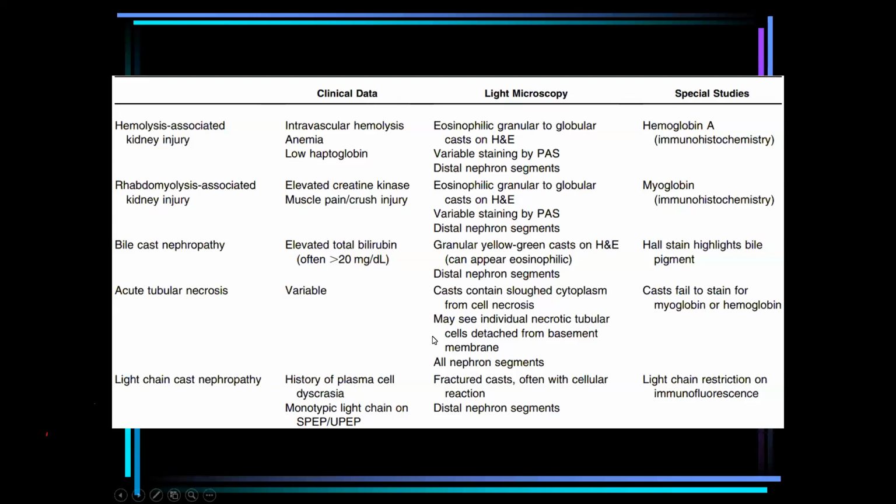So together with our colleague, I think you have to share with me and Dr. Hisham the likely opinion about this good table in front of us. And I think together with Dr. Hisham, it will be a good examination question for our colleagues about the types of cast nephropathy in pathology.